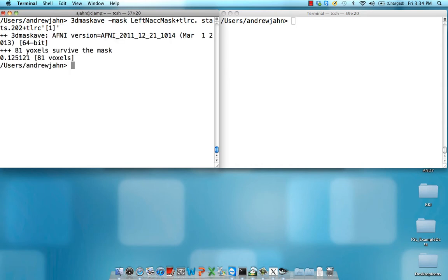It says 81 voxels are within that mask, so I'm only looking at 81 voxels, and I'm taking the average beta weight across all those voxels. And the average beta weight is 0.125.